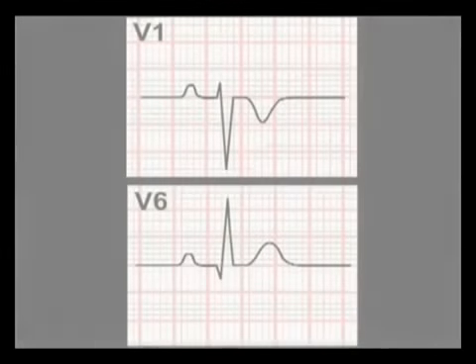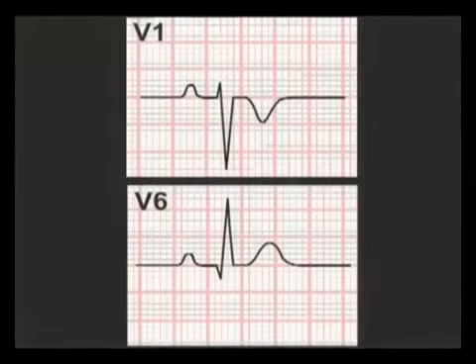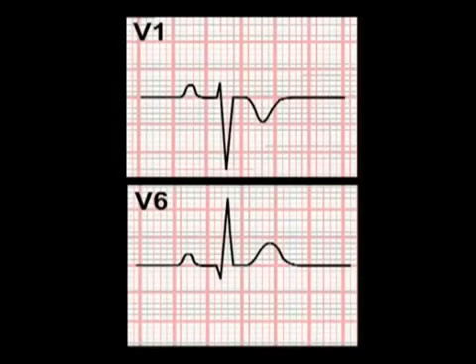To understand how the ECG readout in an individual lead is generated, we need to make sure that you are familiar with the nomenclature of this readout. Remember, the deflection produced by atrial depolarization is termed a P wave, while ventricular depolarization produces the QRS complex. The nomenclature of the QRS complex can cause some confusion, but is in fact quite straightforward.